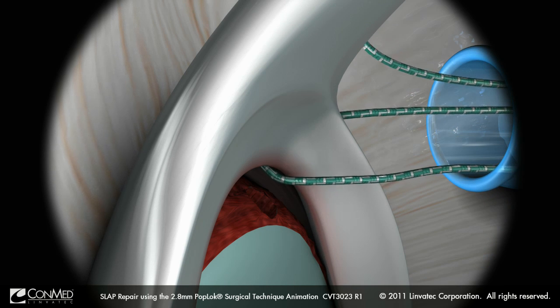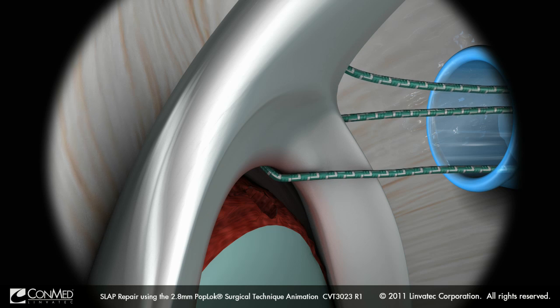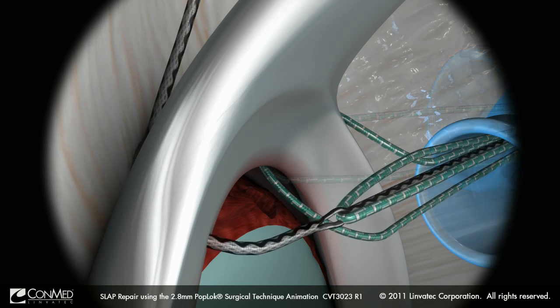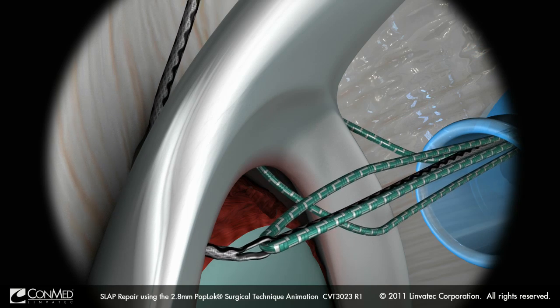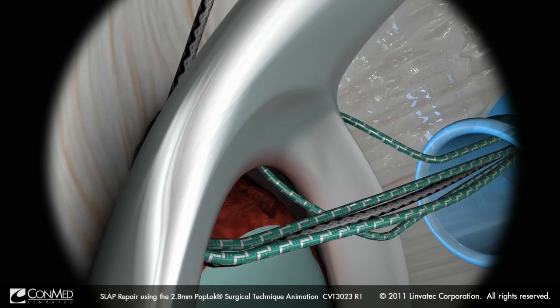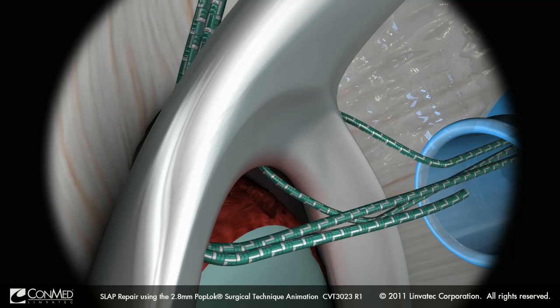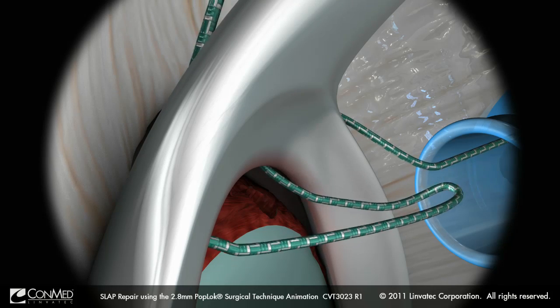Suture management is improved by then retrieving this suture end out the anterior portal. The remaining end of the Hi-Fi suture is then passed in a similar fashion, however this time posterior to the biceps tendon, creating a loop anterior to the biceps anchor.